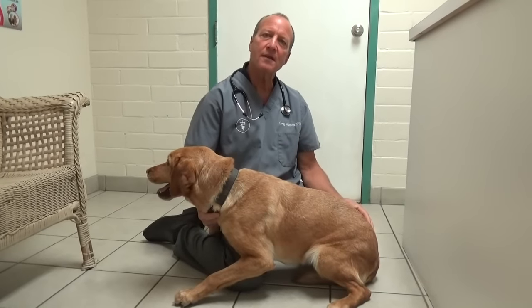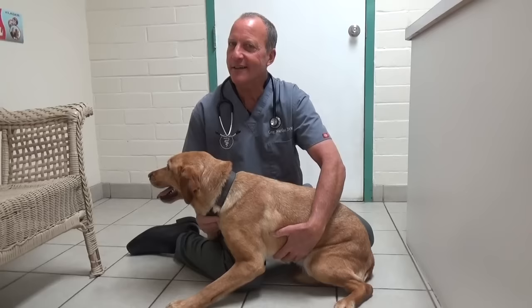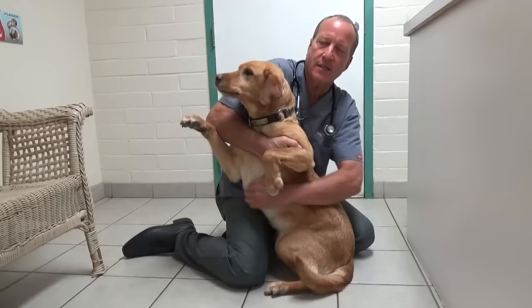So Bear's going to be spayed today. What that means is we take out Bear's ovaries and uterus. Why do we take the ovaries and uterus out of dogs? Well, because the ovaries secrete estrogen, and estrogen causes the mammary glands to develop. And dogs with ovaries have a higher incidence of mammary tumors.